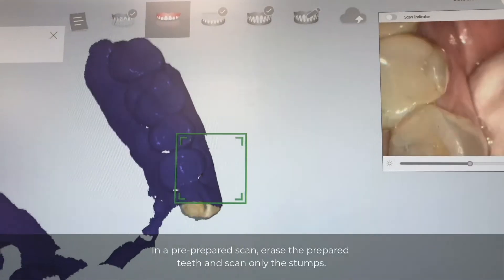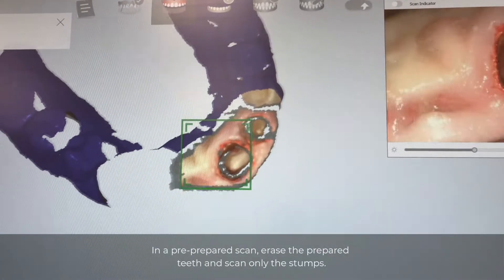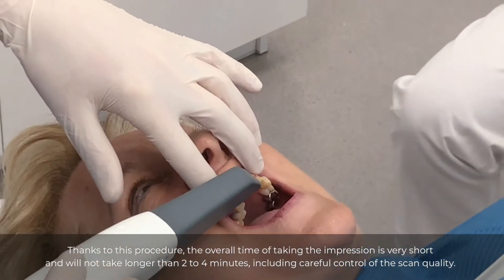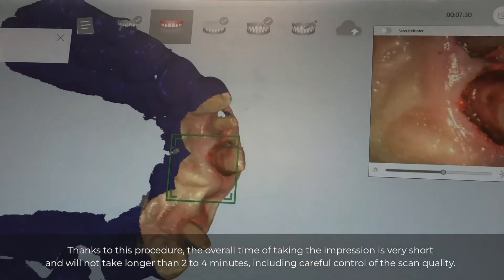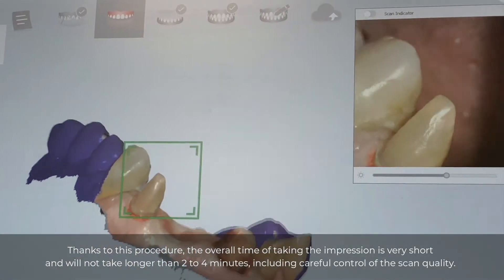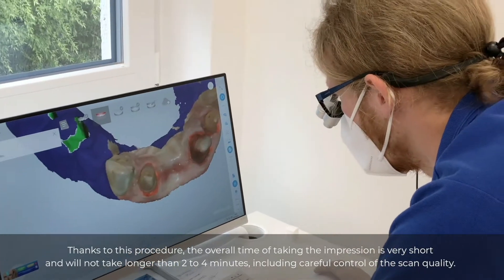In a pre-prepared scan, erase the prepared teeth and scan only the stumps. Thanks to this procedure, the overall time of taking the impression is very short and will not take longer than two to four minutes, including careful control of the scan quality.